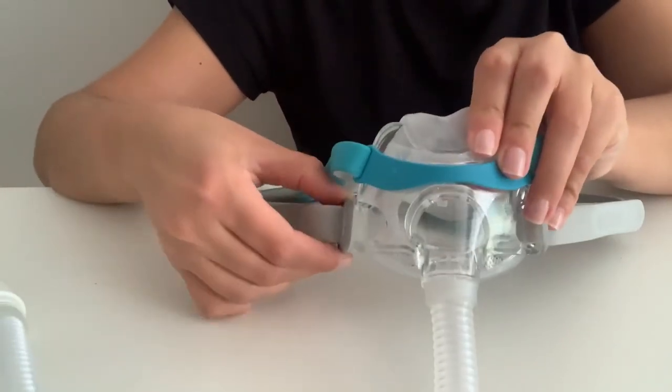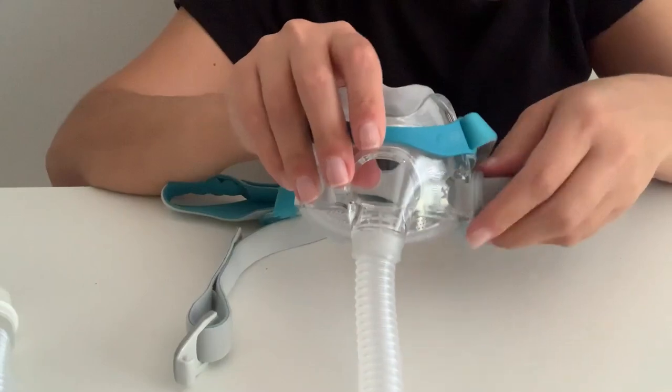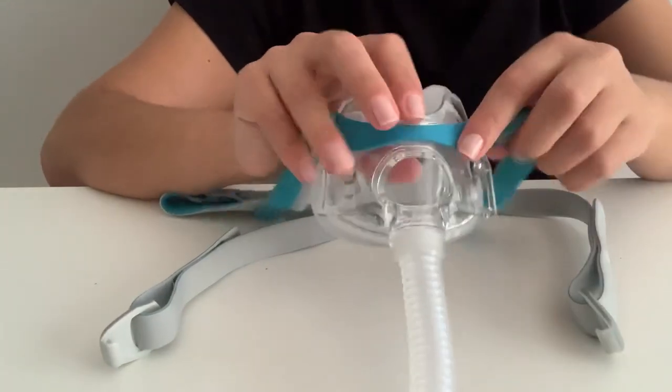To disassemble the Evora full, first take apart the headgear by pulling the clips off the frame and unclip the top.